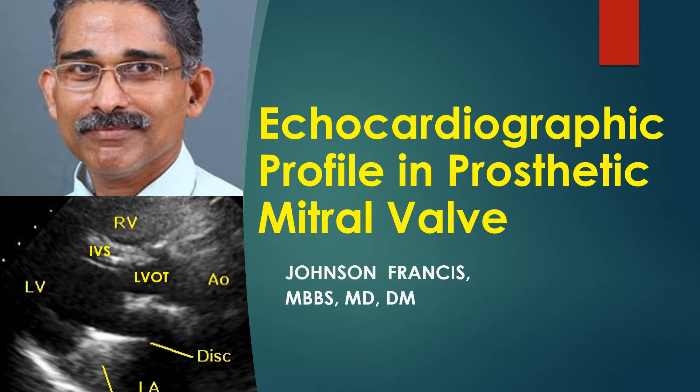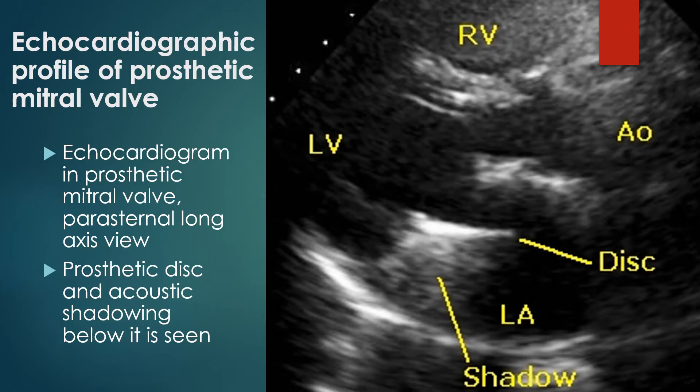Echocardiographic profile in prosthetic mitral valve. We start imaging from the parasternal long axis view, abbreviated as PLAX. In this view we can see the outflow region of the right ventricle and basal part of the left ventricle, with the interventricular septum in between. The left ventricular outflow tract above the mitral valve leads to the aorta, and the left atrium is seen posterior to the aorta.